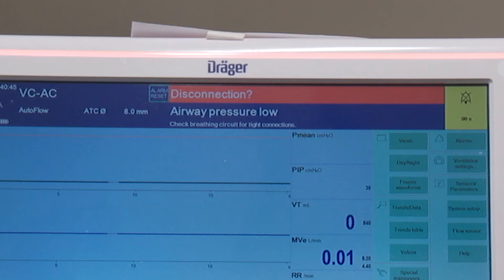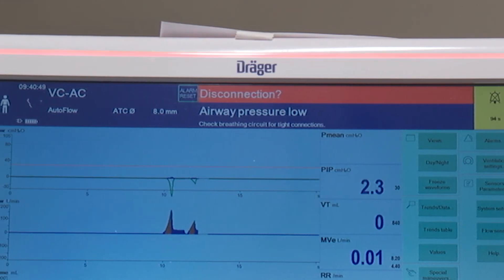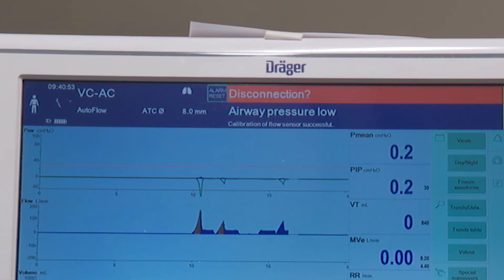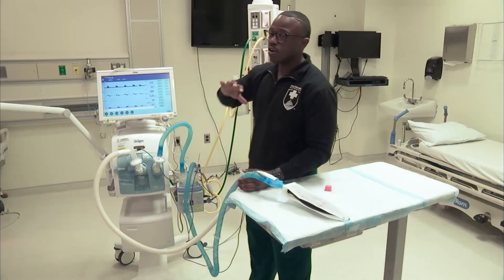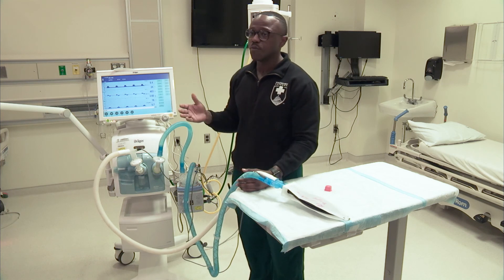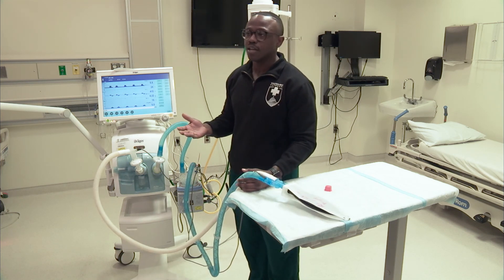Up at the top screen, this portion right here will be where the alarm messages will be. If you look at the middle left-hand screen, where it says VC-AC, all of your modes will always be there — so if you change the mode to something else, it's going to be right there. We here at Walter Reed leave all of our V500 interfaces the same way so that all of our providers rotating through know what they're looking at every single time.